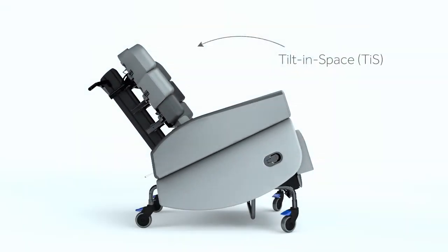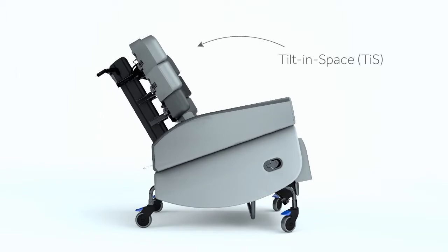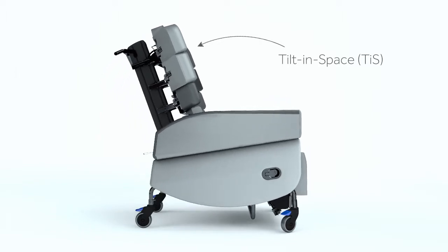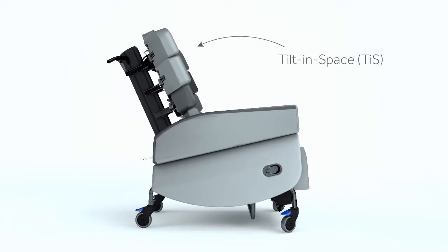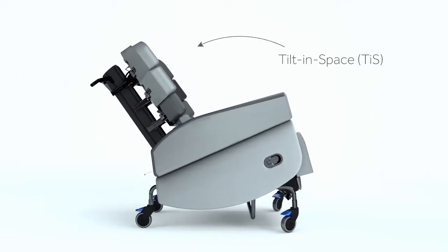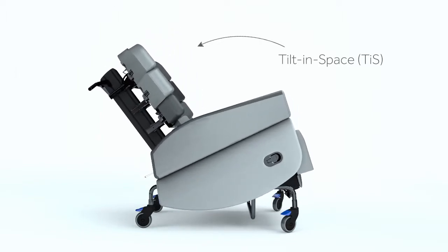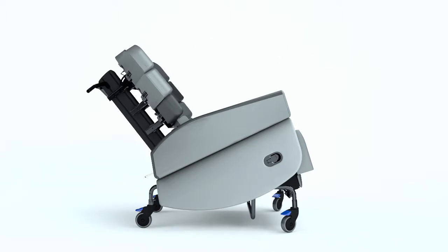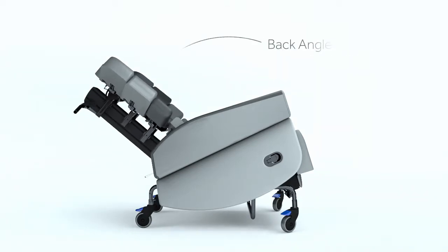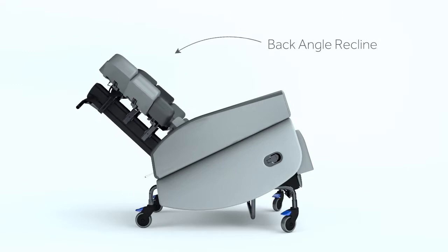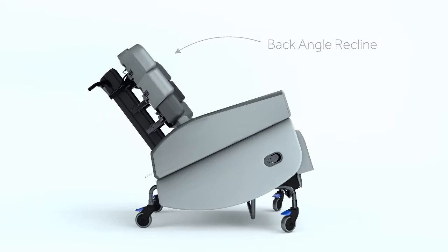The Smart Seat Pro tilt-in space mechanism allows the user to recline comfortably without affecting their hip and knee angles, helping to reduce fatigue and pressure. While back angle recline creates a comfortable hip position.